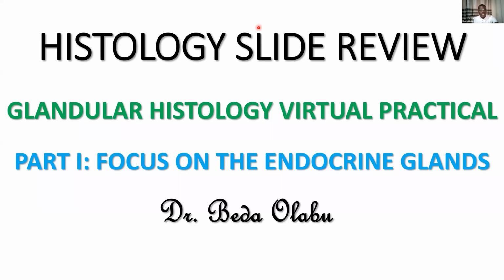Right, welcome once again to this virtual class where we are going to do a virtual practical of histology, focusing on the endocrine glands.